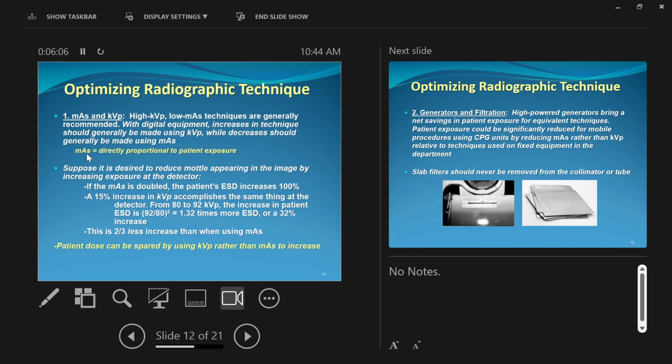Increase technique, right? Because this large patient is thicker. How much do we have to increase technique by? We'll get there, but just as a general idea, we have to double our technique, twice as much, because every 4 centimeters, so let me write this rule down, 4 centimeter rule.